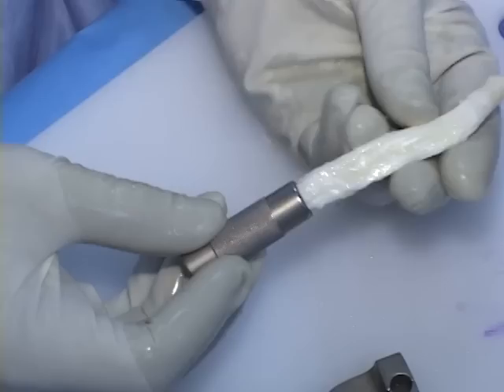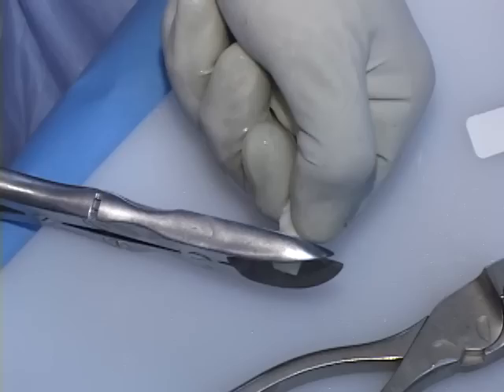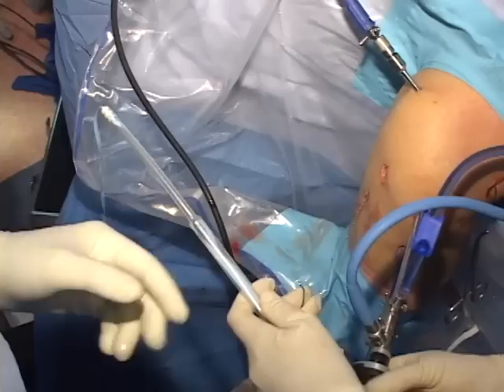Attention is then turned to the ACL allograft. We prefer a pre-shaped bone patellar tendon bone allograft that has been washed with one of the cleaning techniques, such as biocleanse or alowash. The cleaning techniques produce a bacterially clean graft, although there still is some risk for viral transmission. Drill holes are placed in each bone block to permit two permanent sutures placed on each end.